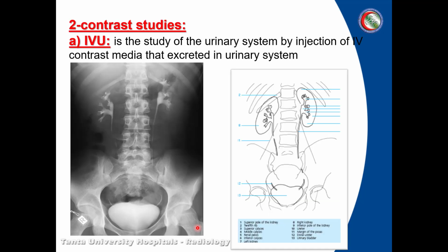The second imaging modality is contrast studies. First one is IVU or intravenous urography, which is a study of the urinary system after injection of IV contrast media that is excreted into the urinary system. So we examine the urinary system starting from the minor calyces.